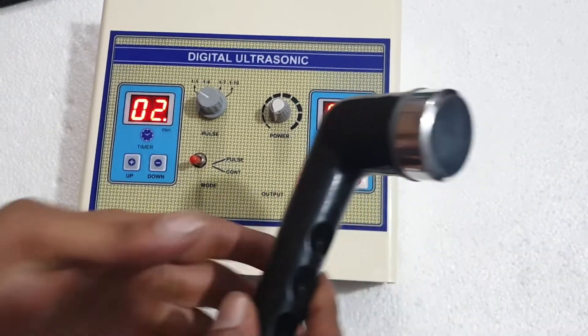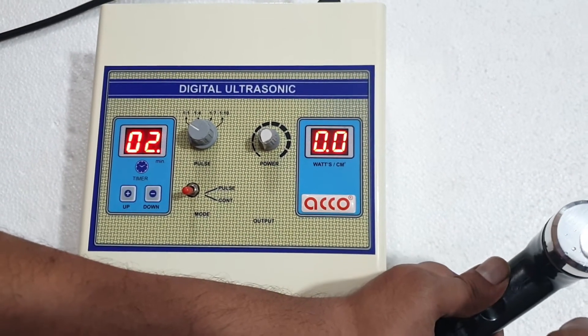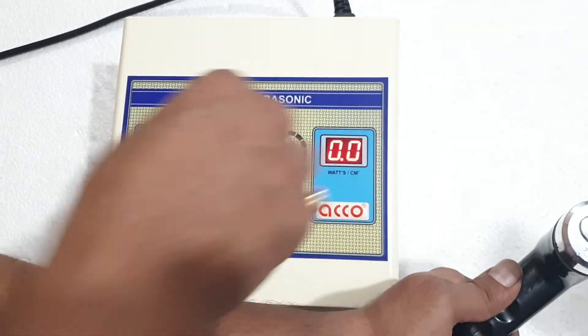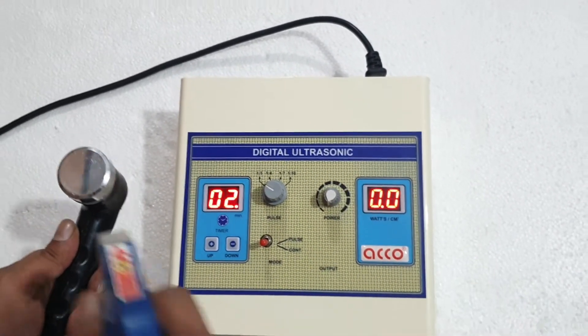Now we will show you the water test on the ultrasound machine. Put some water on the handle. It is on continuous mode. Increase the intensity now.